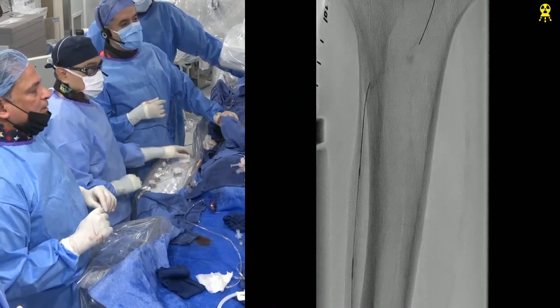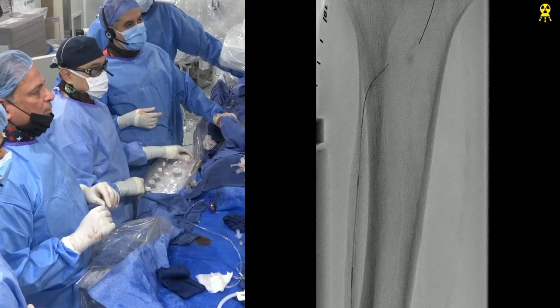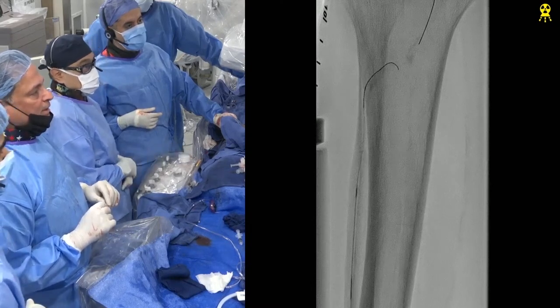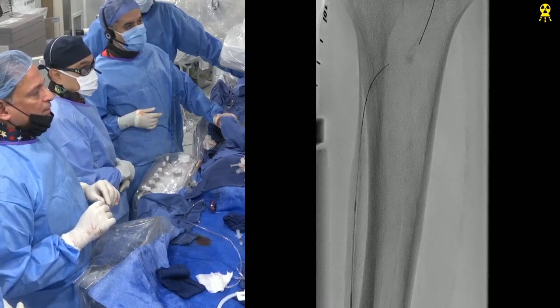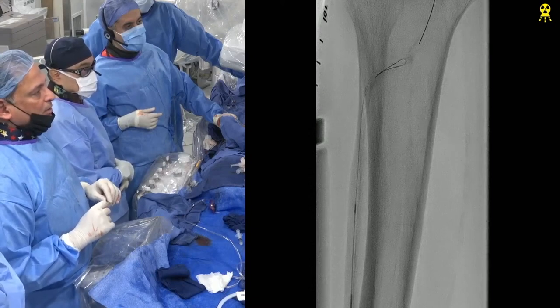So do you prefer? One other thing you really want to be careful about is, when you might have a dissection plane here, which you already do, the question is, was it the loop of the wire that caused this dissection? That's what I'm worried about. You've done so much work here. Now, if you end up with a dissection here, now you're in trouble.